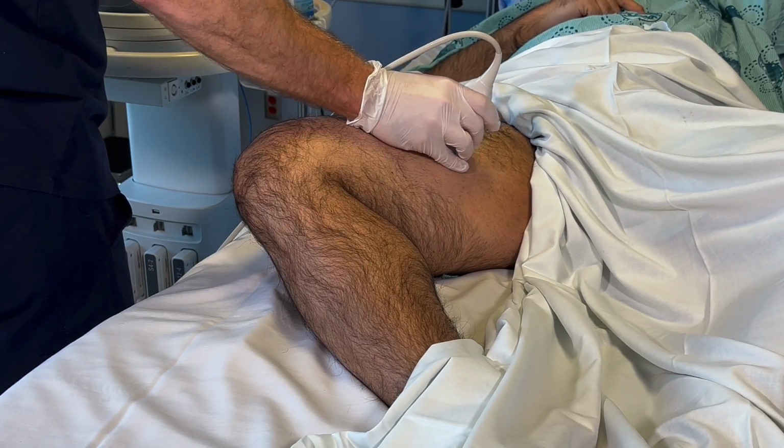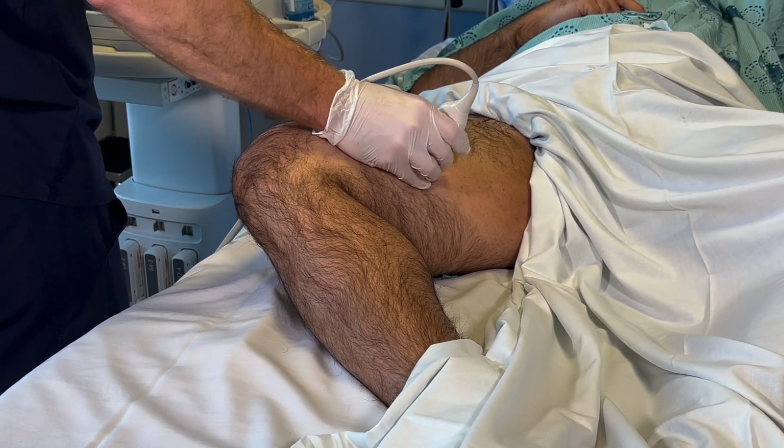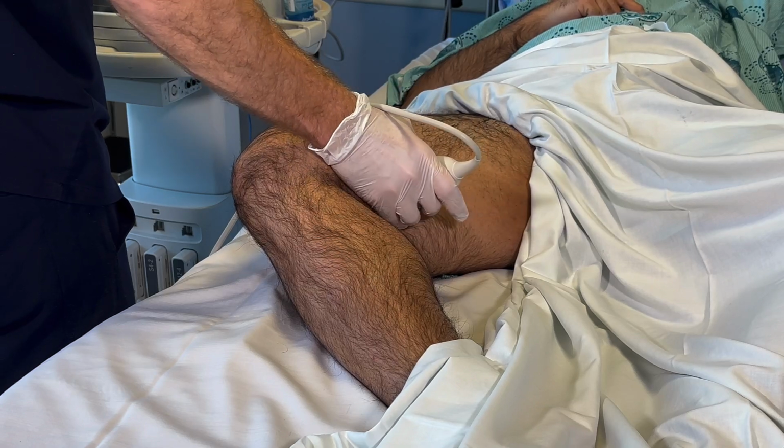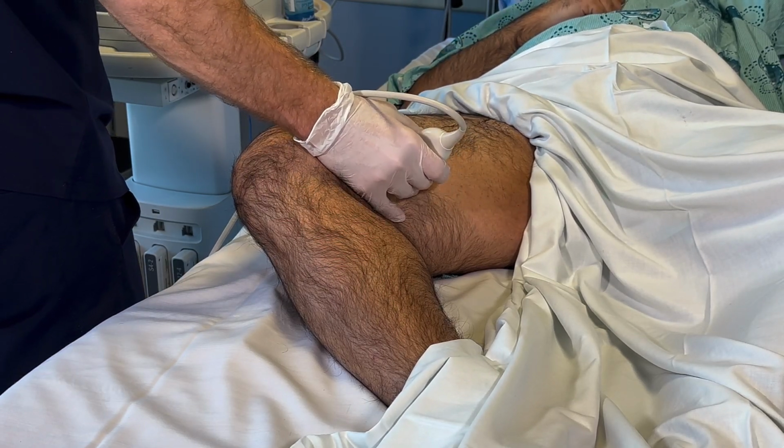I advocate for using an extended compression ultrasound protocol that includes a full assessment of the femoral vein all the way down the leg to the popliteal fossa, as an estimated 5 to 7% of DVTs occur there. To do this, simply continue past the deep femoral vein takeoff, following the femoral vein down the leg until it becomes the popliteal vein. While this can be a little tricky in patients with larger legs, increasing the sensitivity of the test is worth the extra effort.